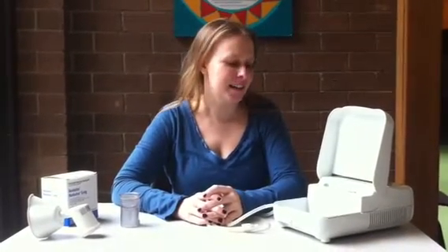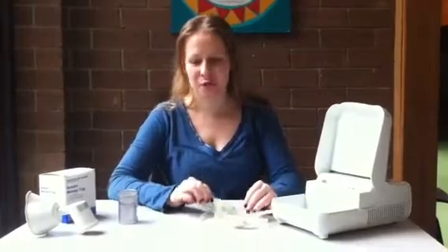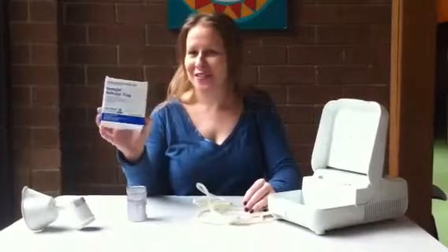This is how you use a nebulizer. First, gather all your required equipment. In this case: a nebulizer, the tubing, the chamber, a mouthpiece, and your medication. We'll use Ventolin.